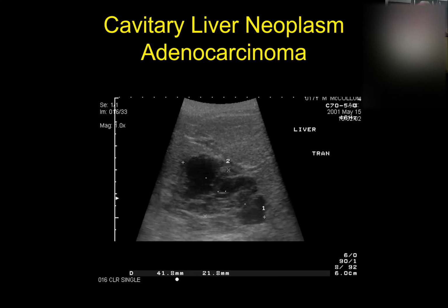Because of those descriptors, I'm going to bet most likely this is some type of malignant mass, and it may also be infected. Some of this may be pus that's starting to form inside this suspect neoplastic mass because it has outgrown its blood supply and the internal parts of it are starting to die and necrose.